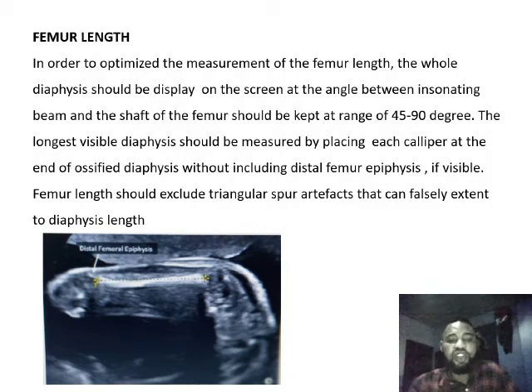This is the image here showing how to measure the femur length. The distal femur epiphysis should be excluded and you measure from end to end.